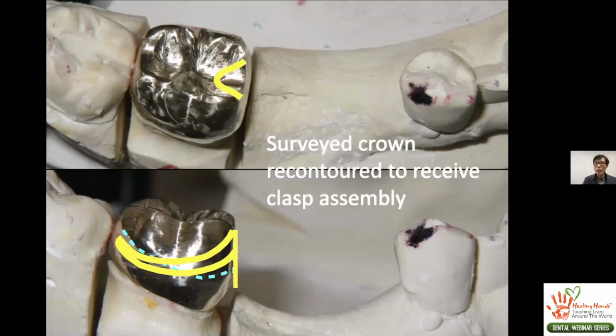A guide plane is a proximal surface that is developed to determine the path of placement that is prepared on the tooth abutment. And the proximal plate is a part of a partial framework. So the proximal plate is going to approximate against the guide plane.